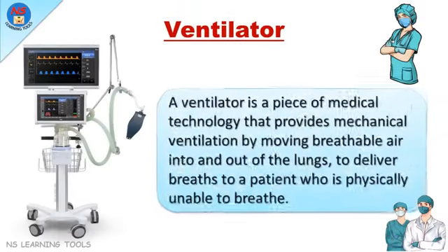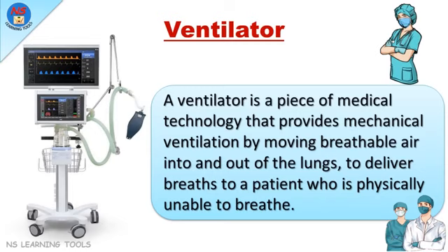Ventilator. A ventilator is a piece of medical technology that provides mechanical ventilation by moving breathable air into and out of the lungs to deliver breaths to a patient who is physically unable to breathe.